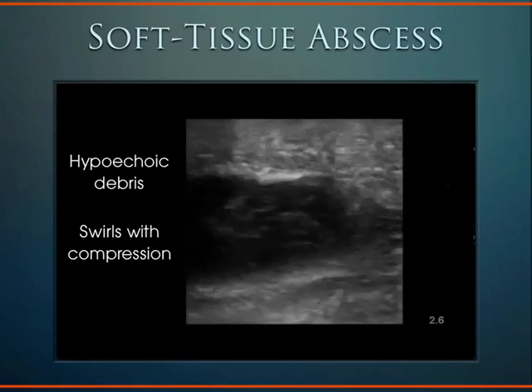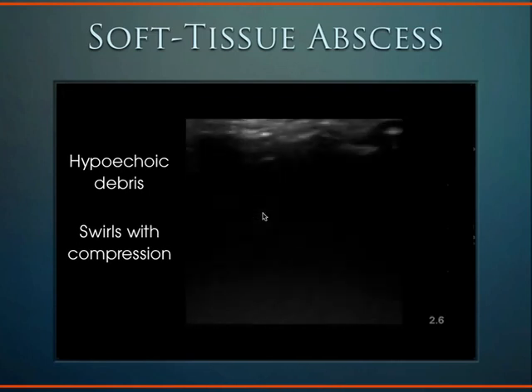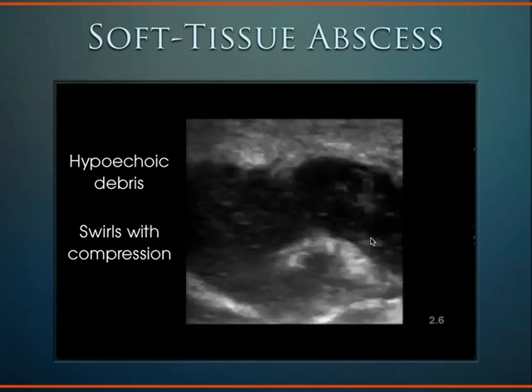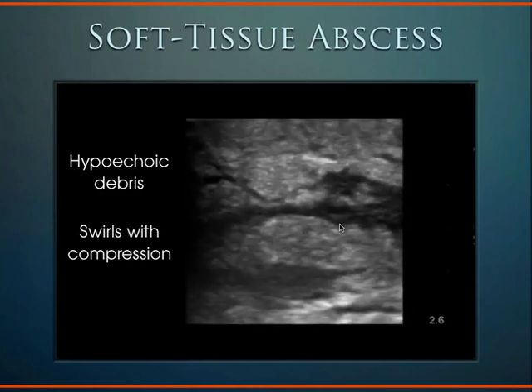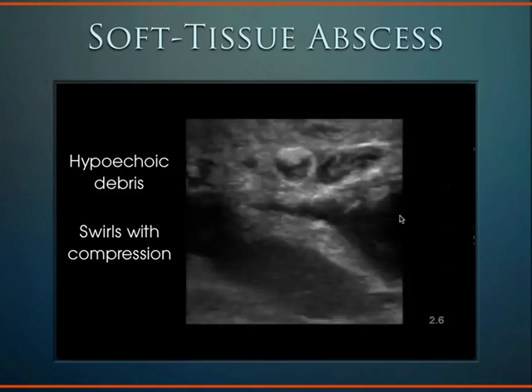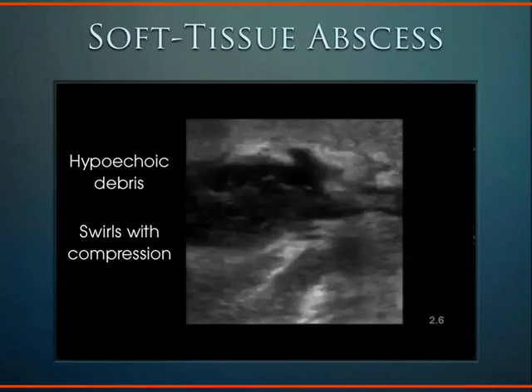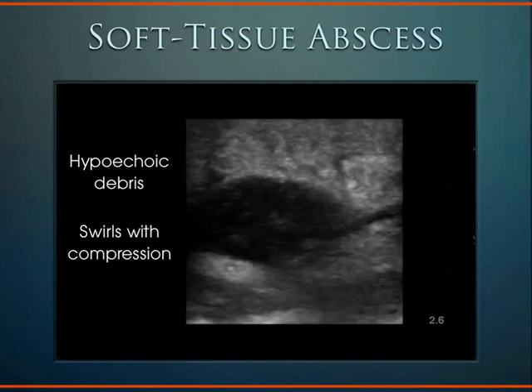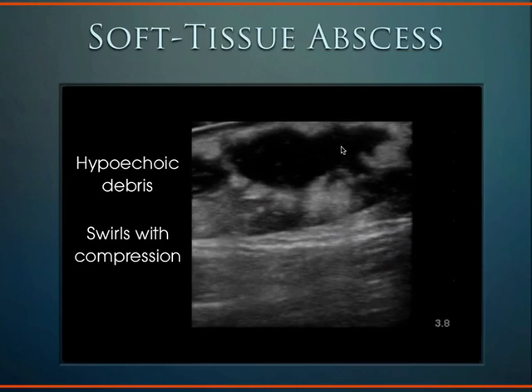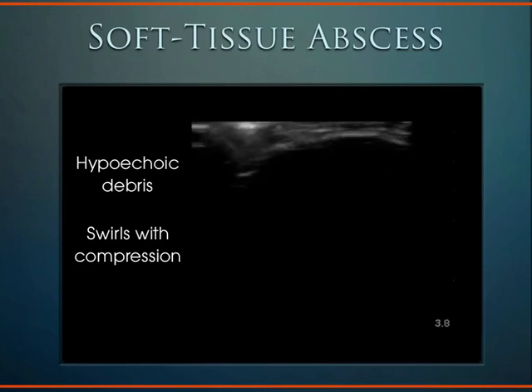Here's another example here of an abscess in this subcutaneous soft tissue. We can see, once we line it up here, we're looking for it. Here it is. We see this debris here. And so many times you see some cobblestoning, but then underneath it you'll see abscess. And other times you'll just see abscess without any subcutaneous soft tissue cobblestoning. Lots of examples of these. These come in all the time. We can see another example here of abscess material in that superficial soft tissue.